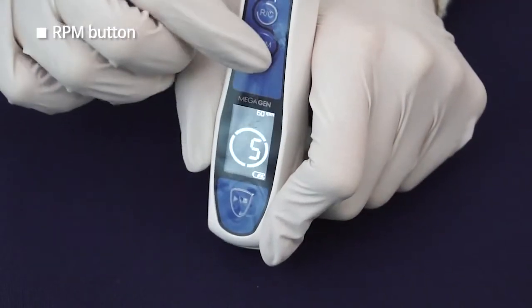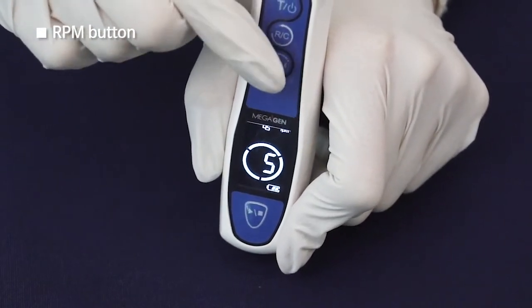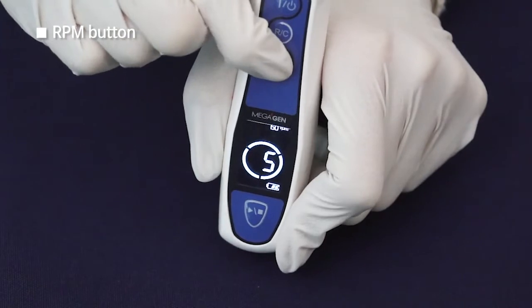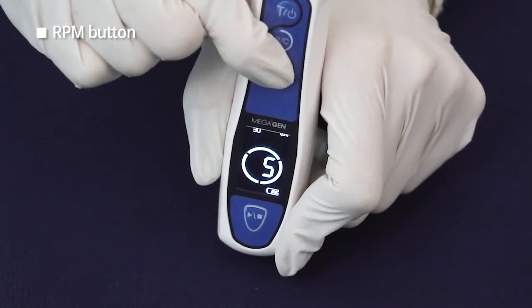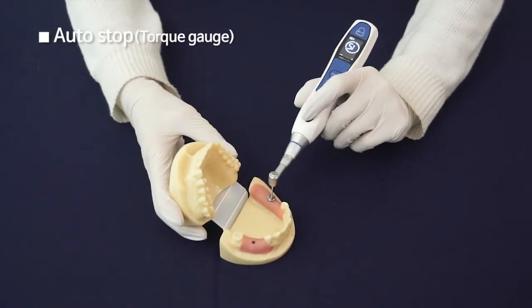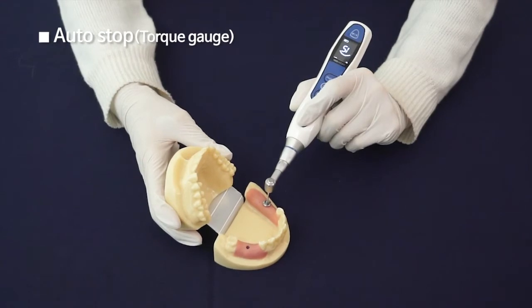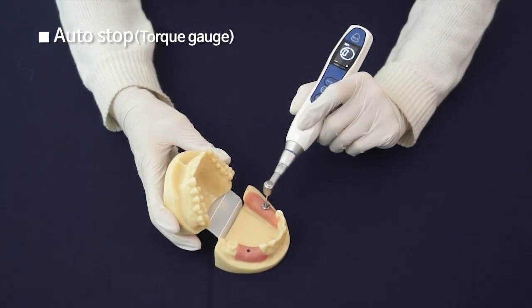RPM Button: The RPM value changes every 15 RPMs up to 60 RPMs. The motor handpiece stops automatically when the torque value is overloaded. The overloaded torque value does not apply on the implant.